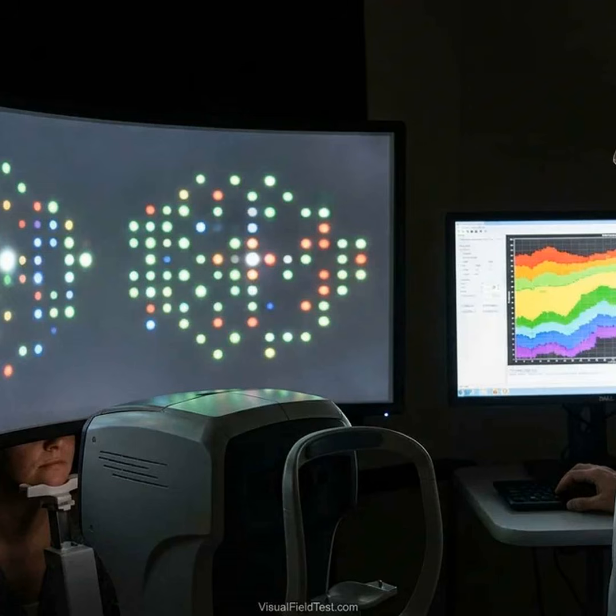Conclusion: color-specific, blue-yellow, red-green, and contrast-specific flicker perimetry enrich our view of visual function by probing the parvocellular, koniocellular, and magnocellular RGC pathways separately. Blue-yellow SWAP tests the S-cone bistratified pathway and often reveals early glaucomatous loss correlating with RNFL thinning. Red-green testing, less commonly used clinically, can expose LM-cone midget deficits.